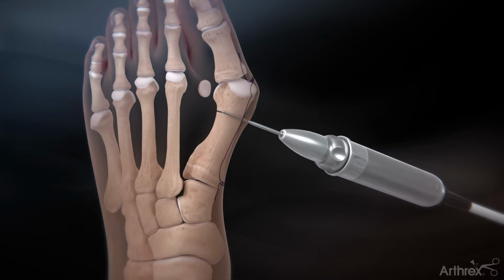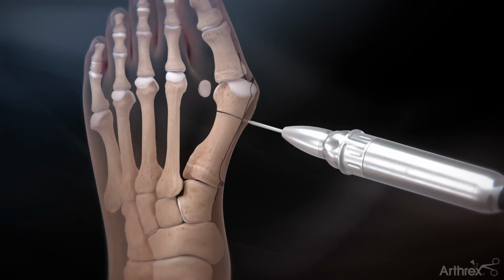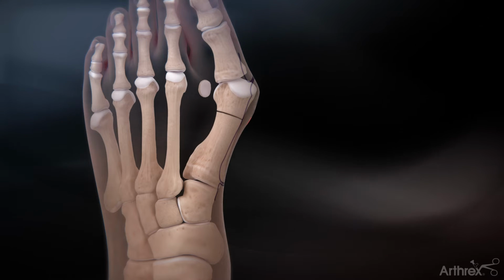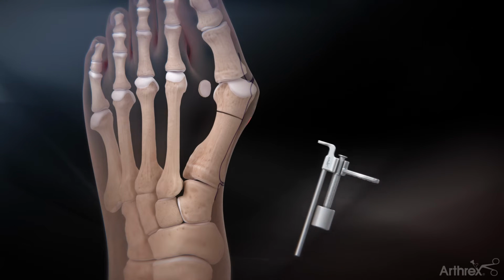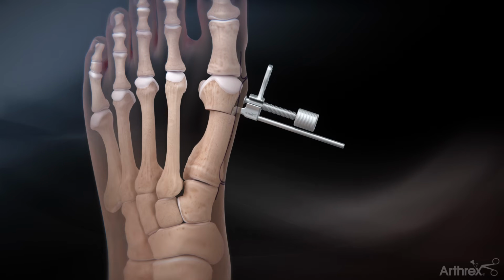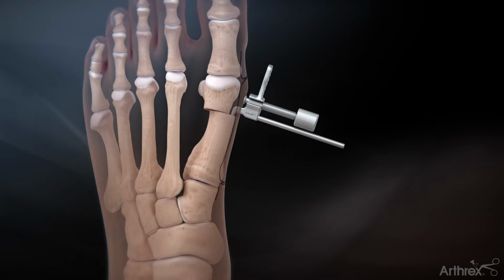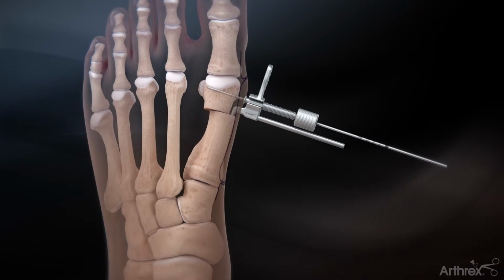For the transverse osteotomy, complete the dorsal portion of the cut first, followed by the plantar portion. Arthrex recommends continuous use of irrigation while performing the cut. Insert the shifting device by placing the hook into the intramedullary canal. Apply any rotational correction that may be needed prior to inserting the guide wire through the shifting device. Ensure that the tip of the guide wire terminates at the lateral cortex.